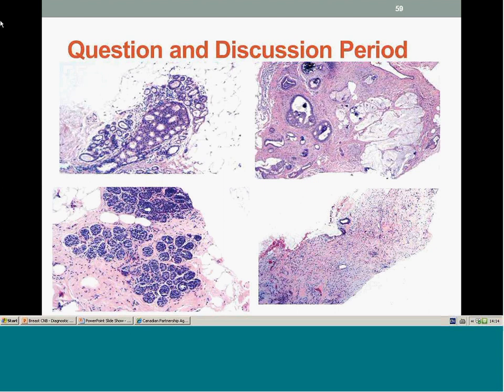And really, I find those lesions not that difficult to pick up in the sense that at low magnification, they kind of remind me of proliferative endometrium. I don't know, that's maybe a funny analogy, but I find that that's the case. And those kind of lesions that look like that at low power, I take a closer look at it, at high magnification.